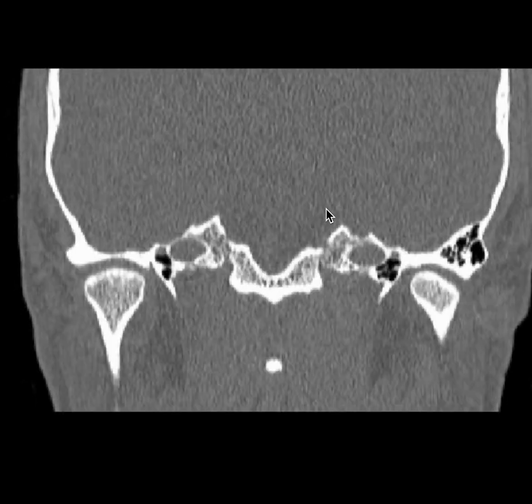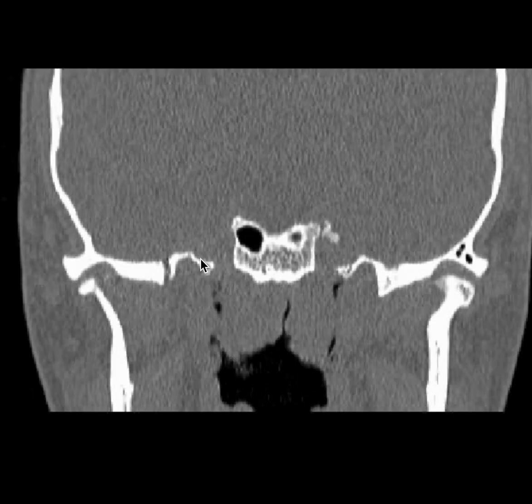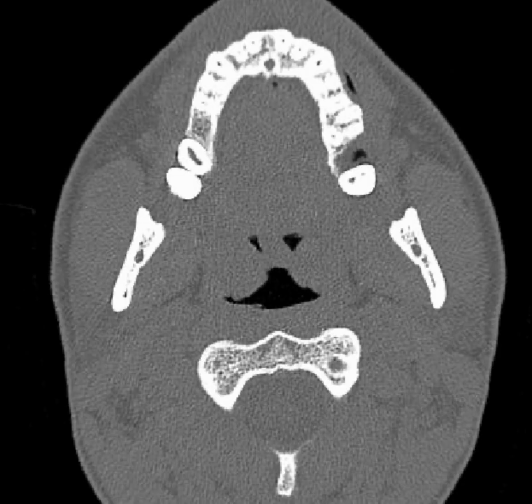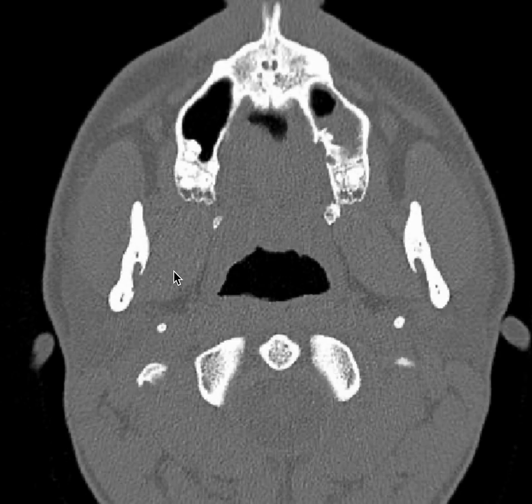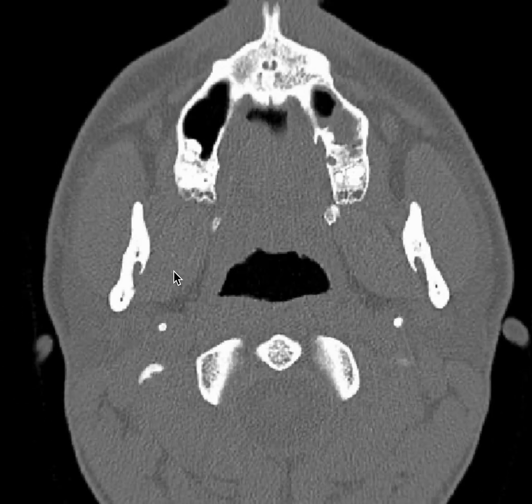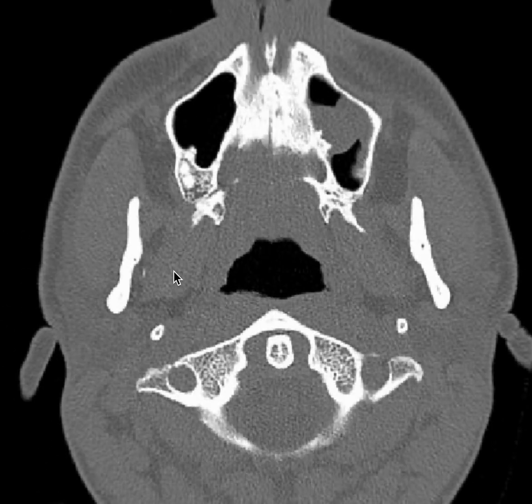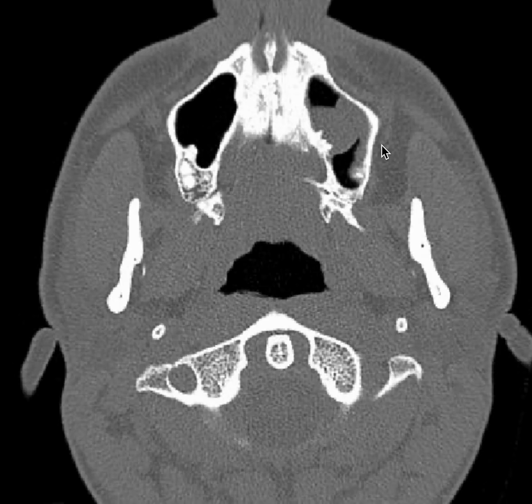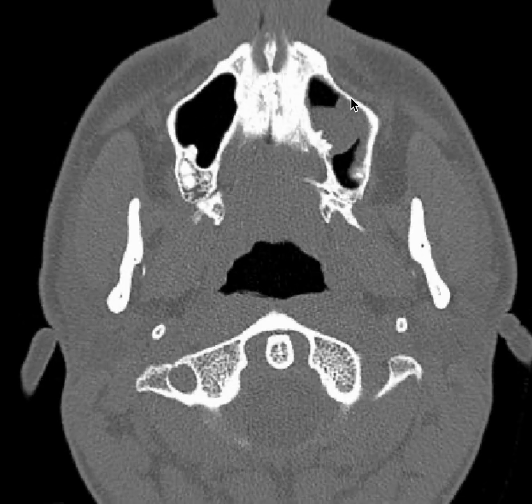Let's see some other images. We have got an axial scan. In axial section, it is helpful to understand if whatever is in the maxillary sinus is a mass or is it a fluid. In case it is fluid, when the patient is lying down, you can see the air-fluid level because all the fluid will be settling down. This can be a retention cyst or polyp.